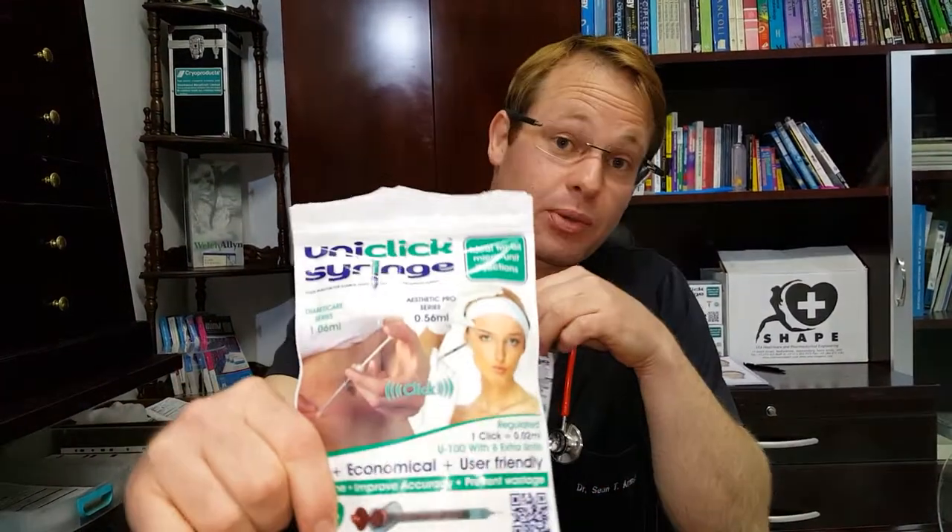I'm Dr. Sean Terence Armstrong and I'm going to be explaining the new UniClick product to you. The UniClick product is basically a normal syringe that has a click function which enables audible, tactile, and visual dose regulation.